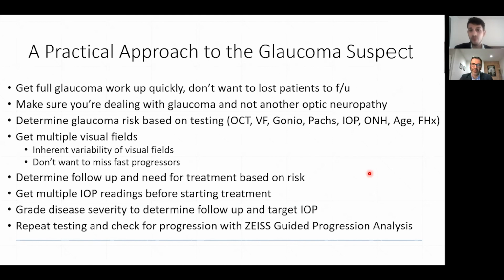And it lets me just do more visual fields on my patients. So I think I might take a hit on the SITA Standard versus SITA Fast variability. You have a little bit more variability, but I'll have more visual fields done in general. So I'll take the hit in one way to have a bigger quantity of visual fields. Yeah. And I think that's one of the papers from Crabb, where he looked at comparing SITA Fast to SITA Standard, and if you have more visual fields, that variability decreases, and you kind of lose the difference, so that SITA Fast is just as good as long as you have good longitudinal data.